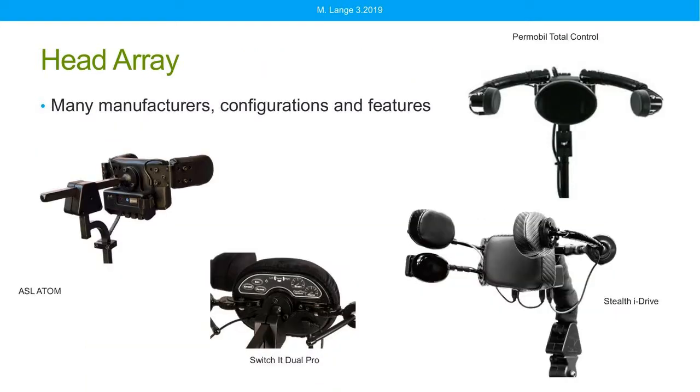There are a lot of manufacturers of these head arrays. Matter of fact, in January, I taught a course that was an hour long on just head arrays. We compared the 8 available models that are on the market. There's quite a difference between each of these, but again, the evaluating team can make that decision on which is the most appropriate. Each of these have different configurations and different features.